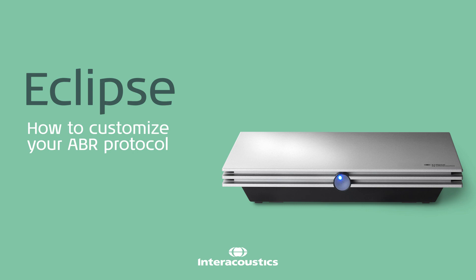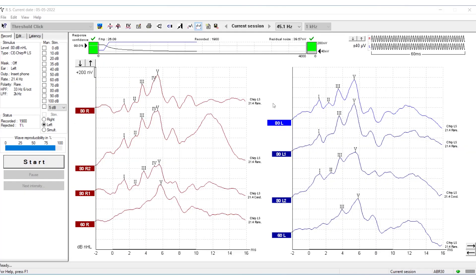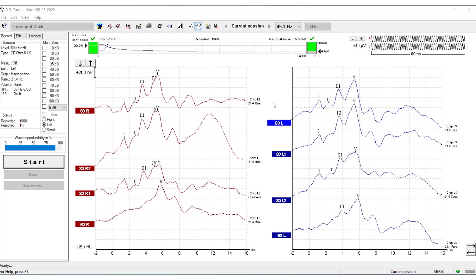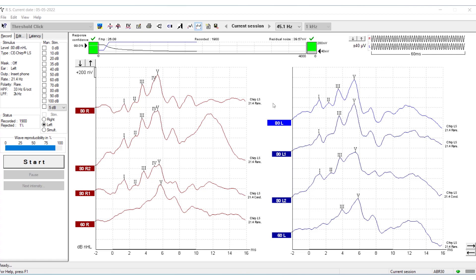How to customize your ABR protocols. This is how you can make temporary and permanent changes to your Eclipse test protocol.